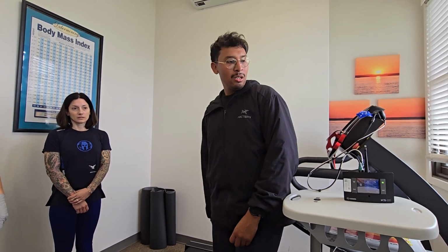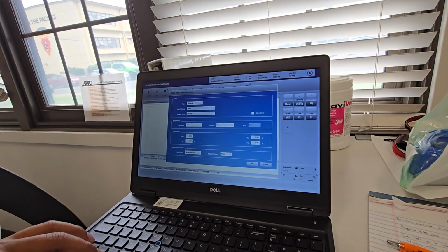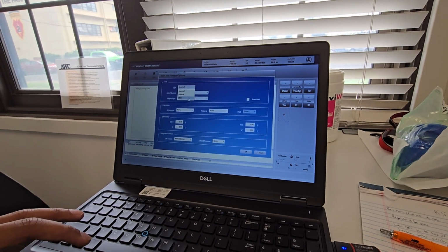Cause I don't think there's a warning for it. No. Okay. I'm going to go ahead and click start. You'll have one last pop-up. You'll have what kind of test you're running: max, submax, or other. I'm just going to click other.